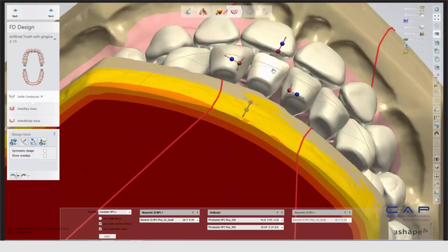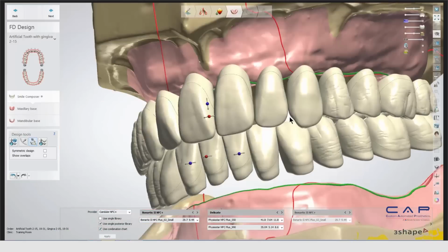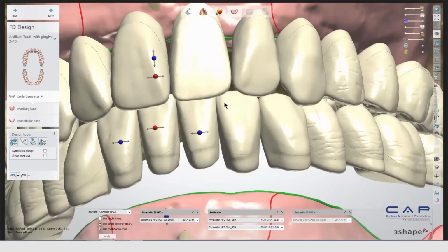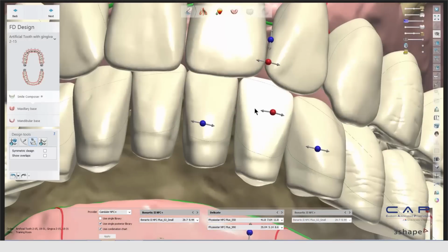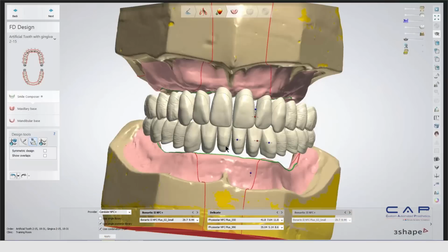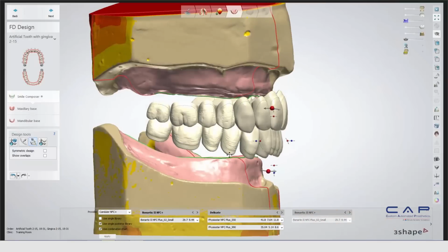Now, normally with these setups, you do want to leave a little bit of space in between the teeth, because if you do have the teeth coming in together, it's going to give you a little warning when you go into the next stage, letting you know that you have overlaps in between the teeth. And we'll see that warning next. So I'm just going to go ahead and say that's okay, and move on to the next stage.